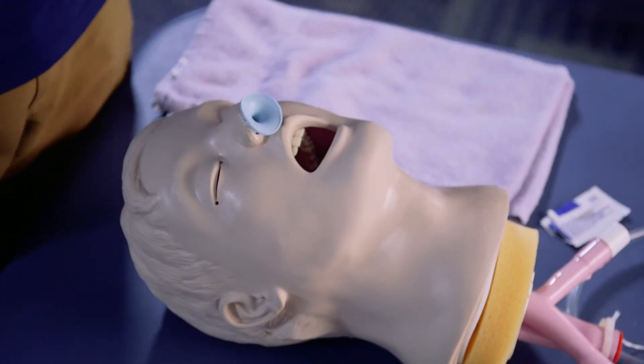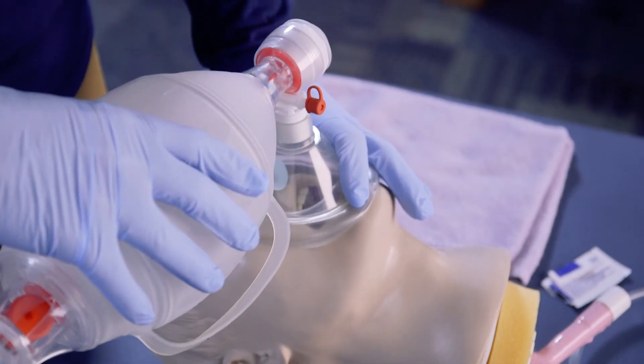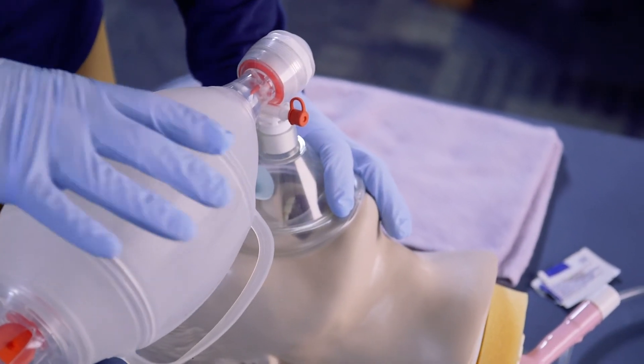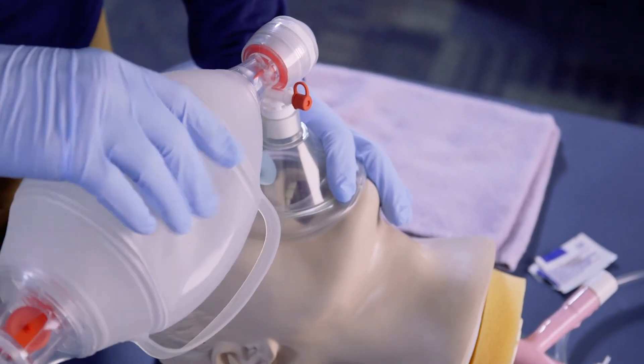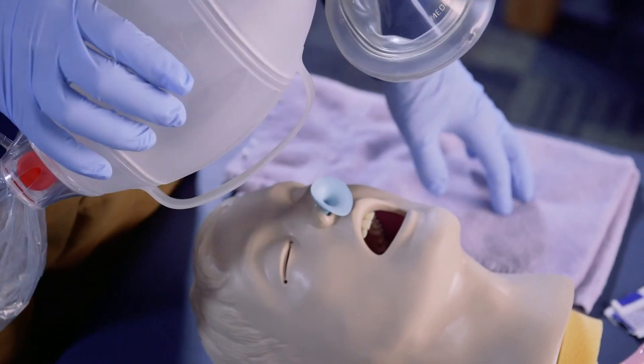Once the NPA is inserted, we go ahead and grab our bag valve mask, place it appropriately, sealing the mask. When we squeeze, the air should go directly through the nasopharyngeal airway and down into the lungs.